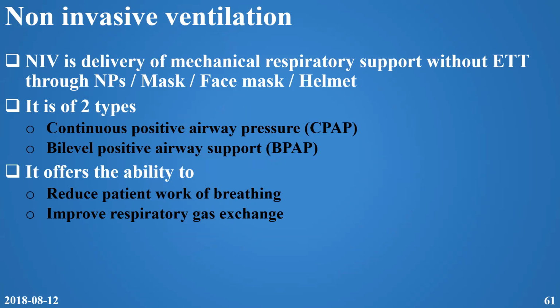So when we say ventilation, previously we were talking about oxygen supply, but some of the oxygen supply systems can provide ventilation, such as the flow inflation bag and the self-inflation bag. Non-invasive ventilation is where we support the respiratory system with oxygen, but with ventilation too. That means we blow in oxygen, we remove CO2, but without an ETT. So that's what we call non-invasive ventilation. Okay?